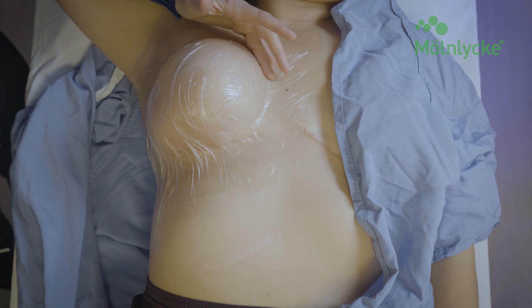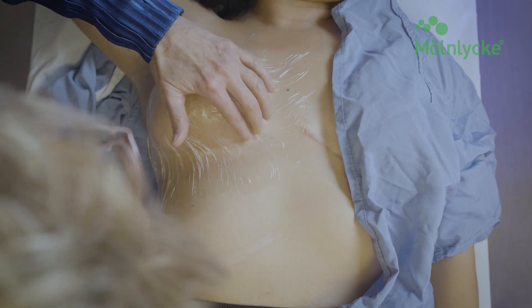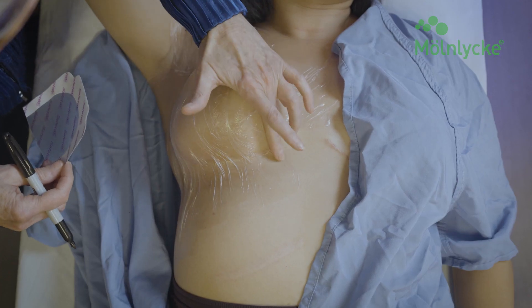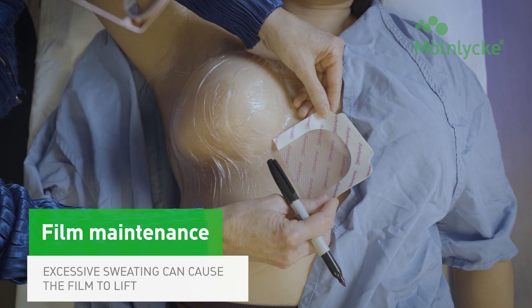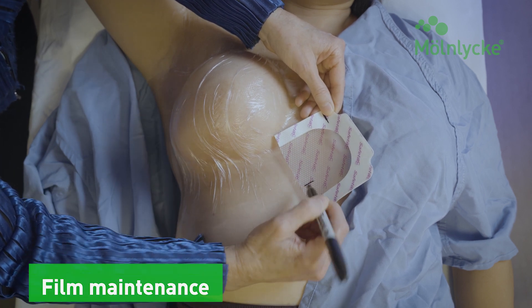In our next section, we will discuss tips and tricks in helping your patient maintain their dressing throughout treatment. Explain to the patient that they can shower with the film on, keeping it in place with a hand towel over the film area — this helps prevent further lifting of the film. Excessive sweating tends to lift up the film, so suggest to the patient that they limit intense physical workouts during the course of their treatments.